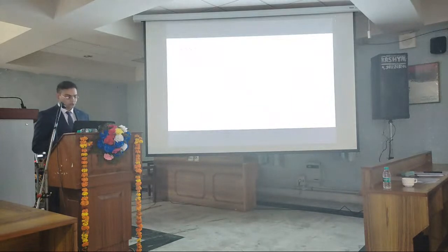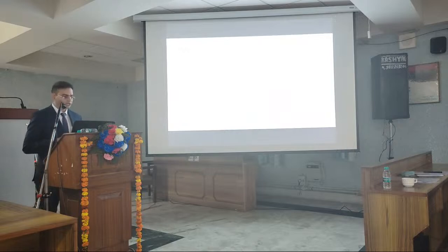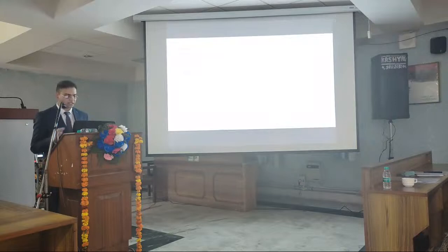Now, what to do when we fail to visualize the sentinel lymph node? That is very rare. However, in 1 to 2% of cases, we are not able to localize the sentinel lymph node. The reason may be old age, obesity, tumor location, multiple factors. But what to do when we don't visualize the lymph node? If we are not able to localize, and if the situation permits logistically, we ideally have to repeat the procedure of sentinel lymph node scintigraphy. And if we are not able to do that, then the answer is to go with axillary lymph node dissection.